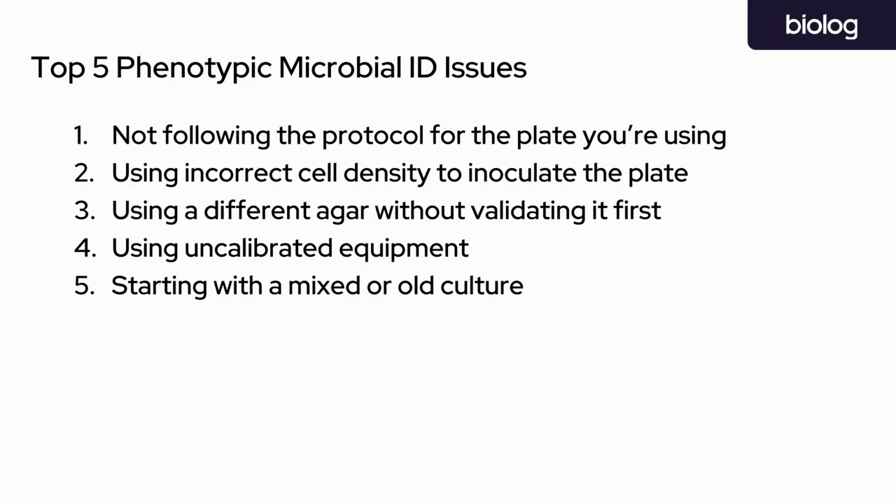When we designed the assay and enter new species into the database, everything is as unified as possible, using that same agar media, the same culture density, et cetera, in order to preserve that metabolic state, because we're quantifying the phenotypic output of these strains instead of just sequencing DNA, for instance. So it's really important not only that the bug is growing, period, but how it's growing.